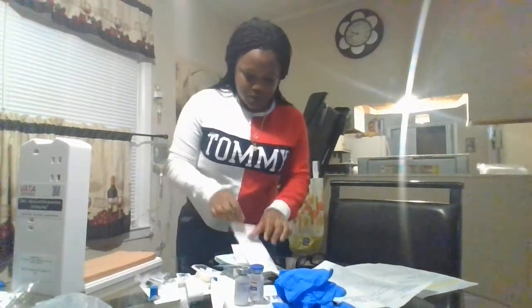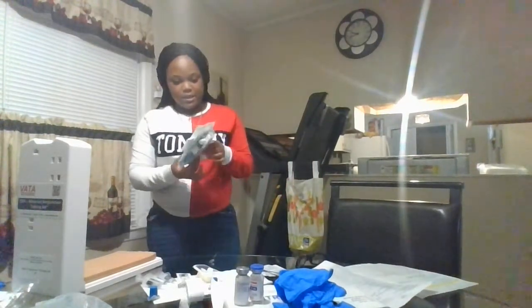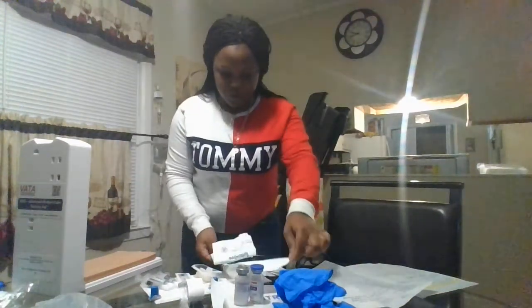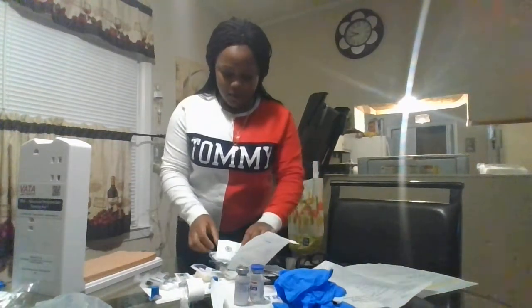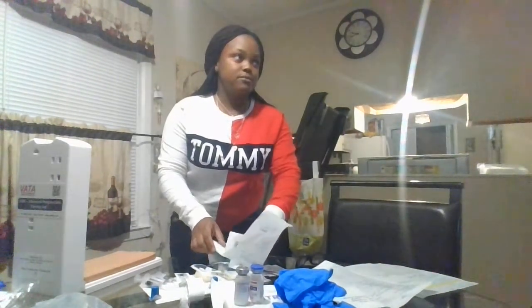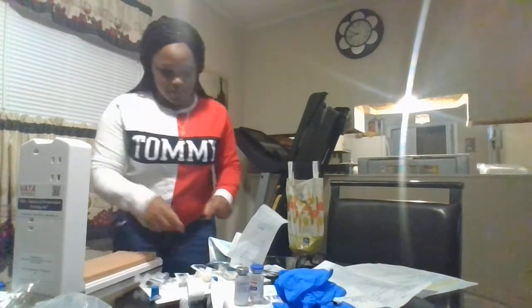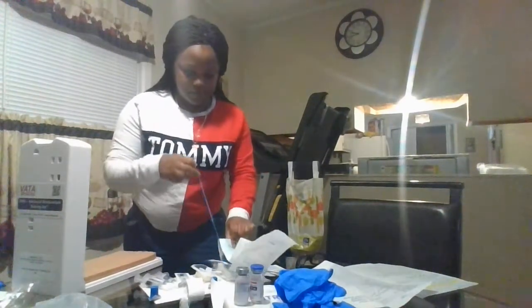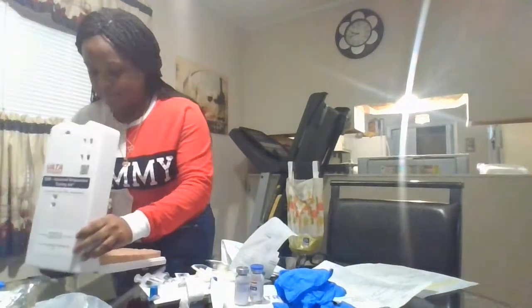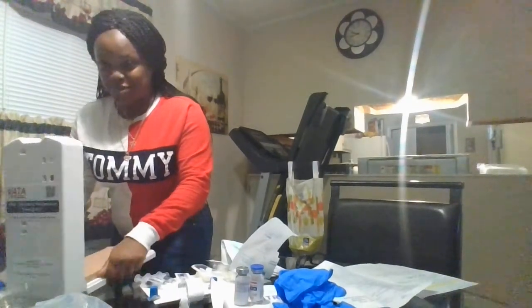All right, I'm going to check my supplies, checking expiration dates. Okay, everything is good. I'm going to open it. I'm going to put on my gloves. Wash my hands. Place my tourniquet. Sorry if I'm lifting up your arm too hard.